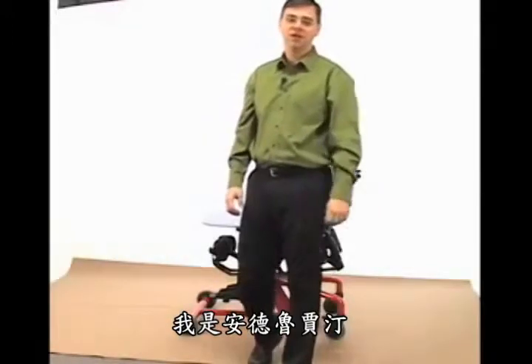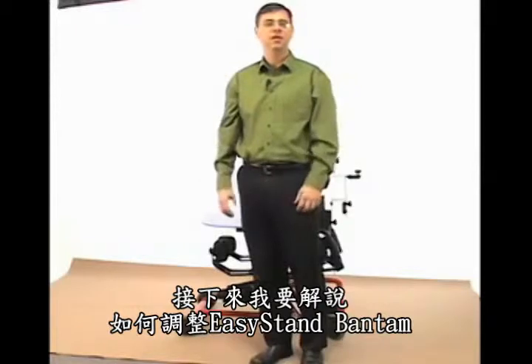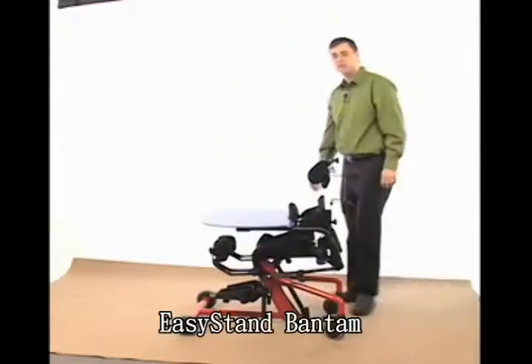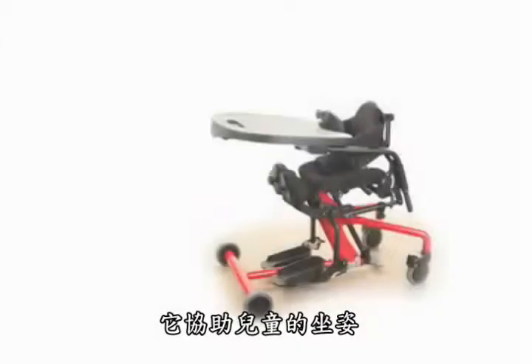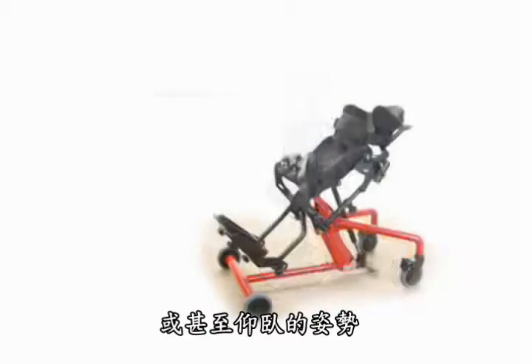Good morning, my name is Andrew Gardene and today we're going to take a closer look at adjusting and fitting properly the Easy Stand Bantam. The Easy Stand Bantam is the latest pediatric stander from Ultimate Medical that accommodates children in a seated position, a standing position, or even a supine position.